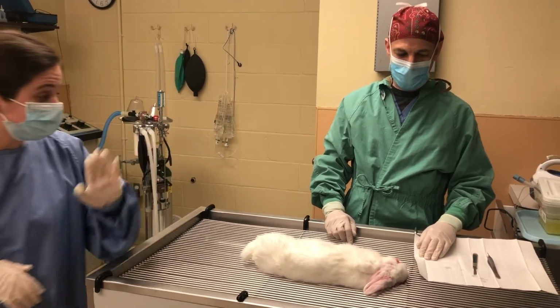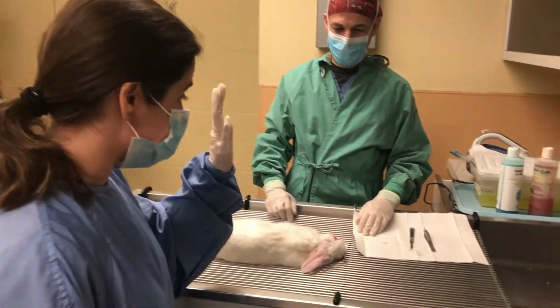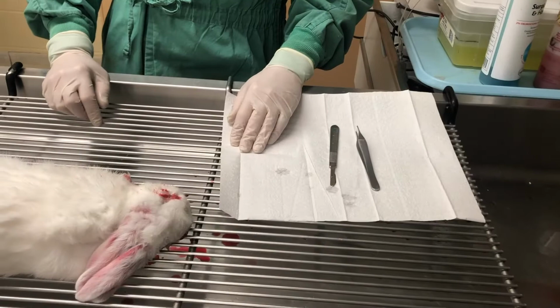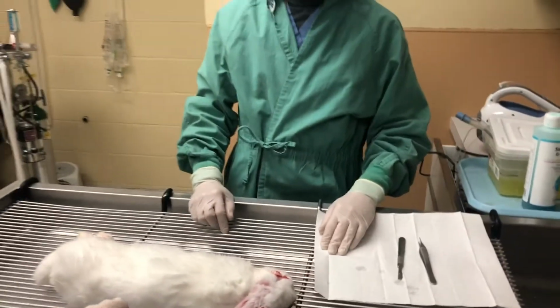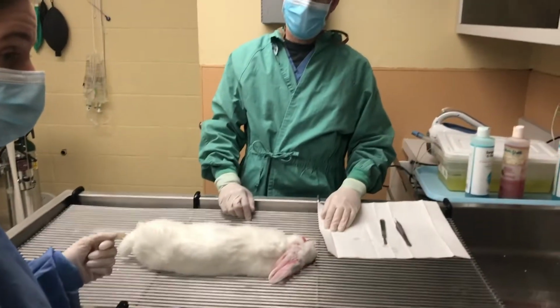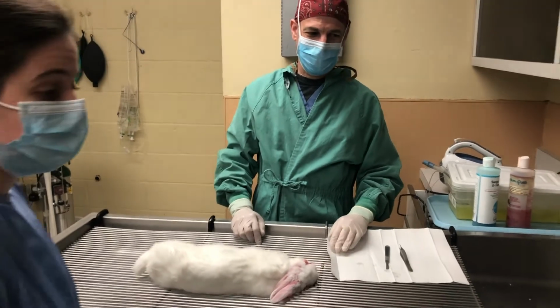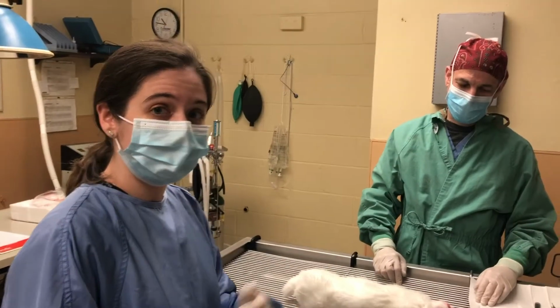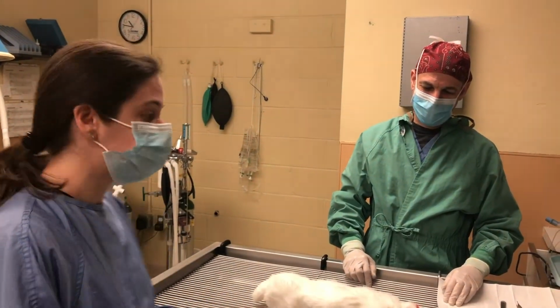So we have our equipment here. Dr. Goldman has his scalpel handle and his blade, which he's going to be using to open the body up. And he has his forceps, which he'll use to collect samples. We also have our 10% formalin jars that we'll be using to hold the samples in if we need to bring them to the lab.